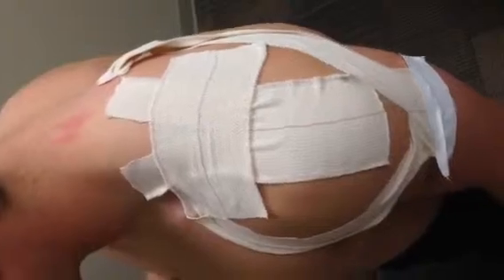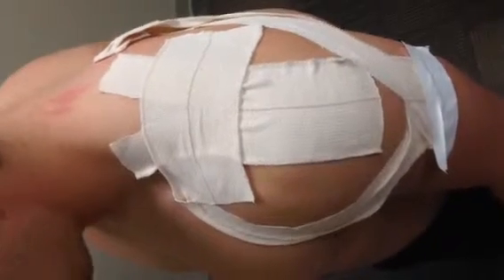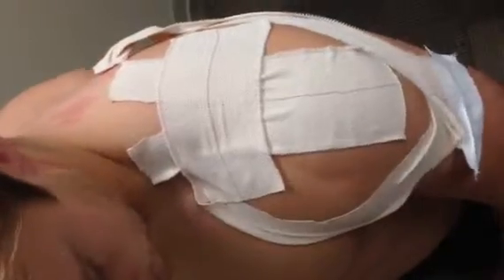A preliminary study was performed, and it showed that there was reduced pain with arm motion 24 to 48 hours after this kinesiotaping technique was applied.